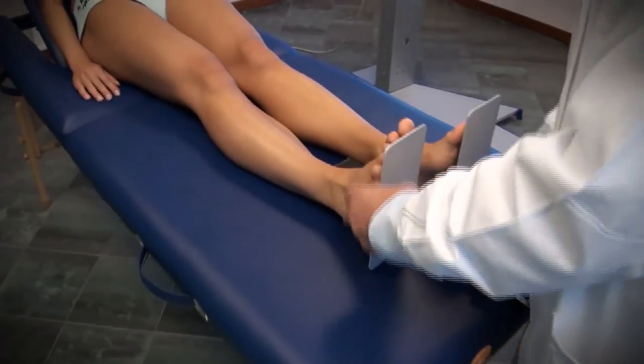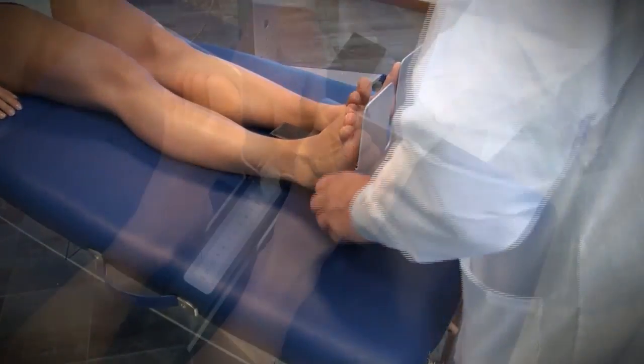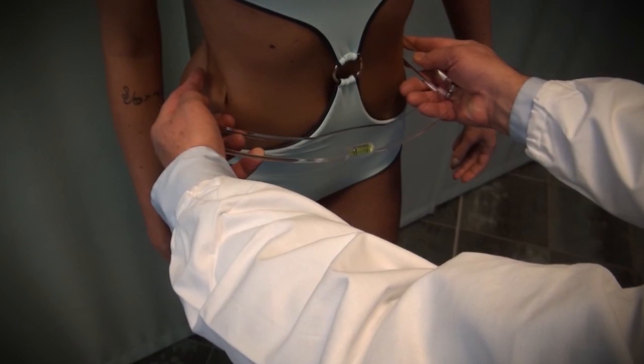The patient's posture can also be examined using other instruments. We begin with the delta leg and find that the left leg is shorter by 1.5 cm. We can do the same checkup using an analyzer and with the shims.